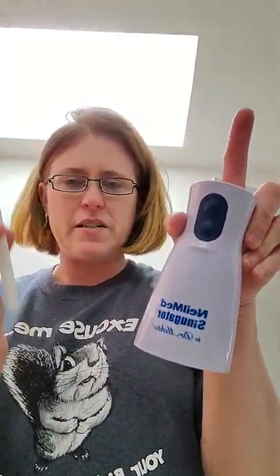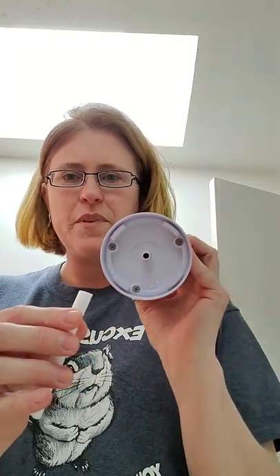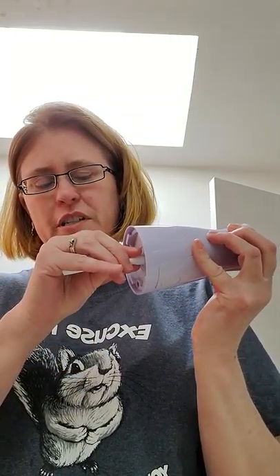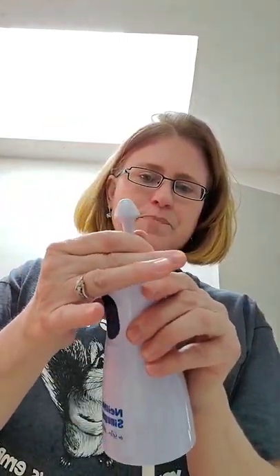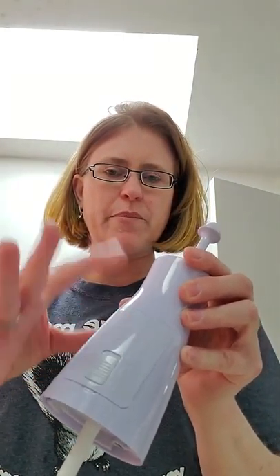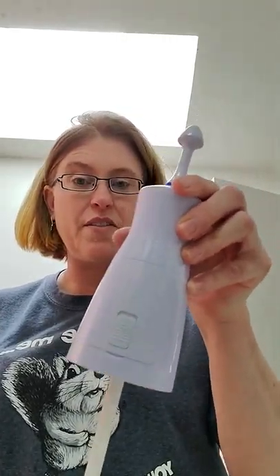You take this out of the box. It comes with a little rubber tube — you just put this on the bottom and push it in there. Then it comes with a little tip; put that right on the top. In the back, you've got to push this up and open it up. It comes with three batteries — they're included in the box.